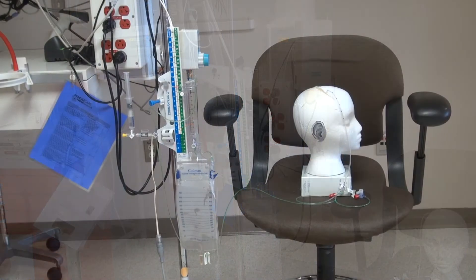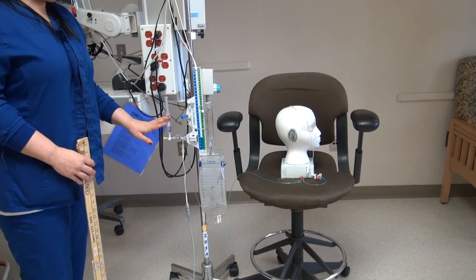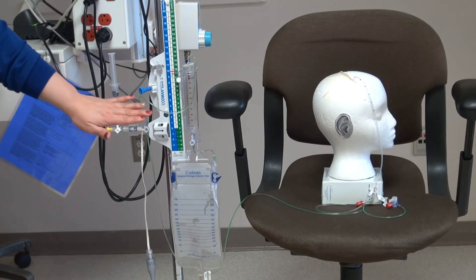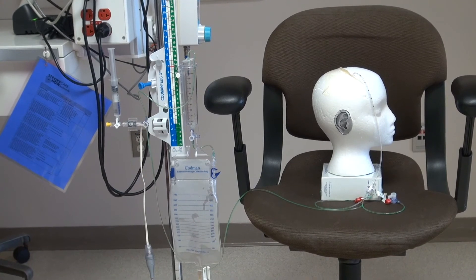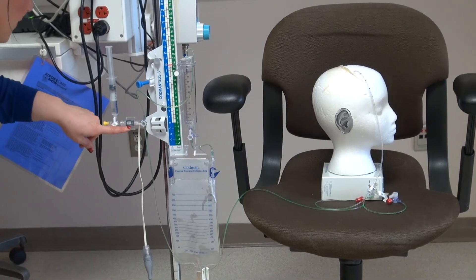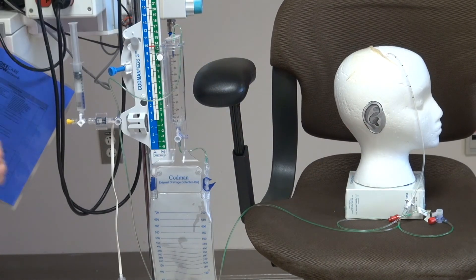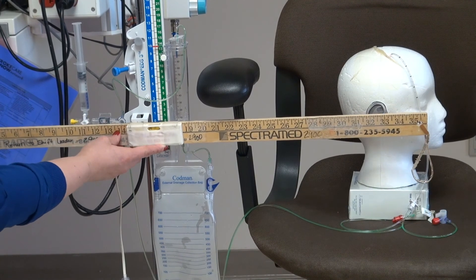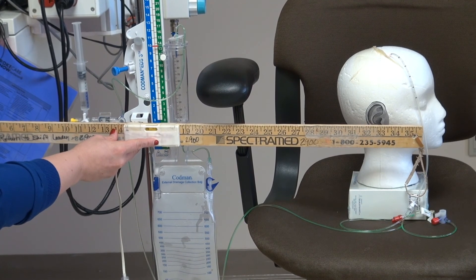For this segment, we are concentrating on leveling our EVD. Our patient already has a drain set up. Anytime we manipulate our patient up in the bed, we have to actually re-level it. Anytime we travel with the patient or lay the patient flat, we do need to temporarily clamp the drain. We want to make sure that our transducer and our stopcock is level with the patient's EAC or tragus, and we actually have a level for that. We want to make sure that this bubble is what we focus on, and this is the correct positioning right here.